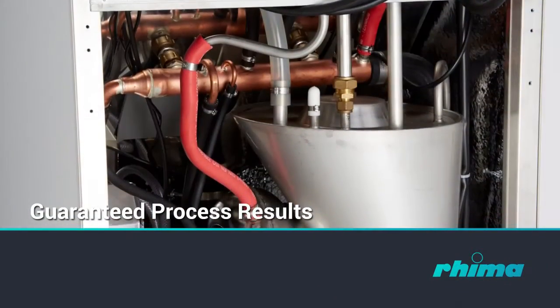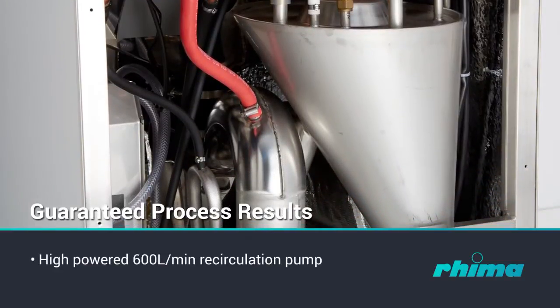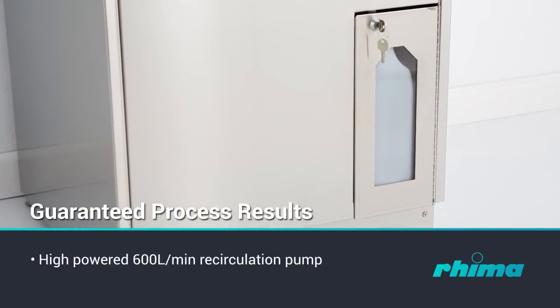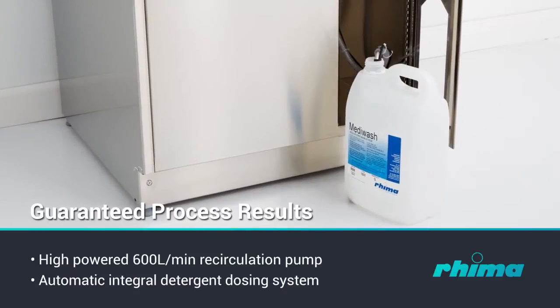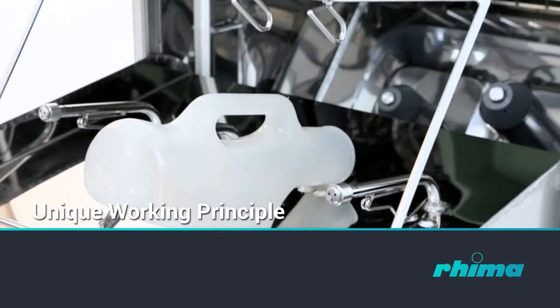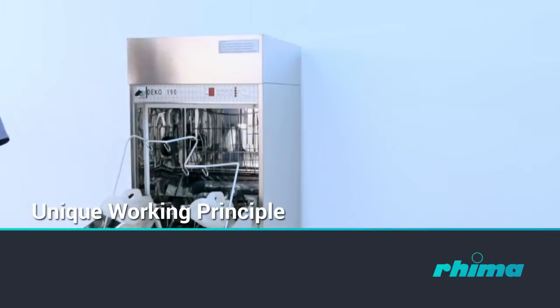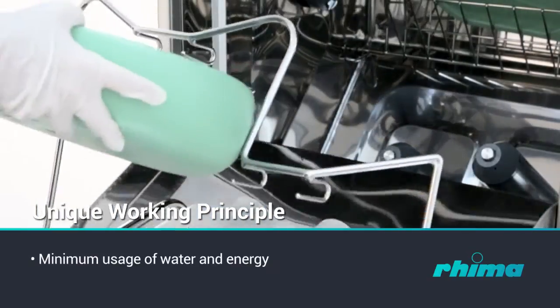Process results are guaranteed. Water pressure for washing is supplied by a high-powered 600 litre per minute recirculation pump. Detergent is injected into the recirculated wash water by the automatic integral dosing system. The unique working principle facilitates cleaning and steam disinfection of the entire system, including wash chamber, water tank and drain outlet, with the minimum usage of water and energy.